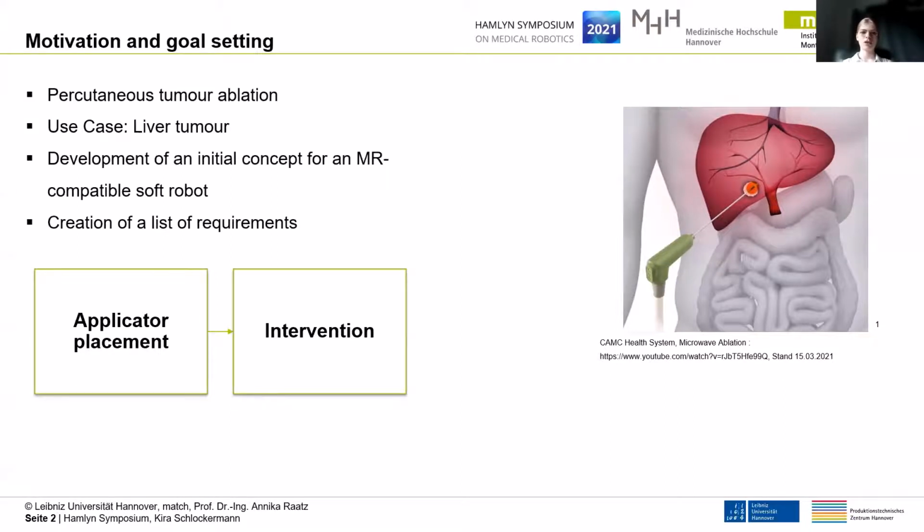The goal of the project is to develop a concept for the safe positioning and insertion of an applicator needle with the help of soft robotics. With this, we created a list of requirements. Important requirements are that the robot must hold an ablation needle safely and keep it stable at the desired position in addition to its own weight.